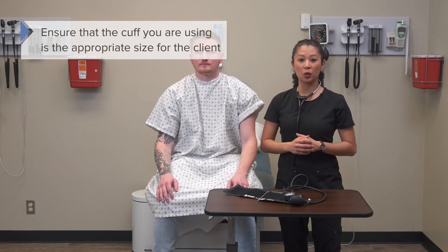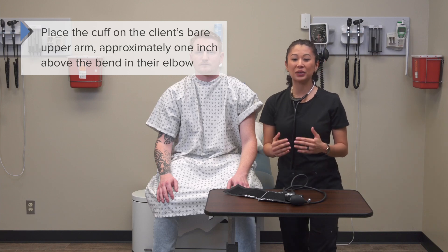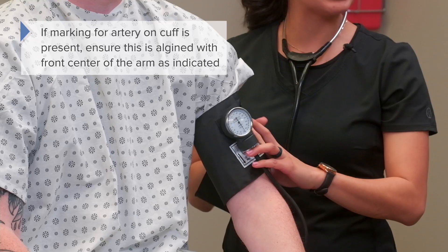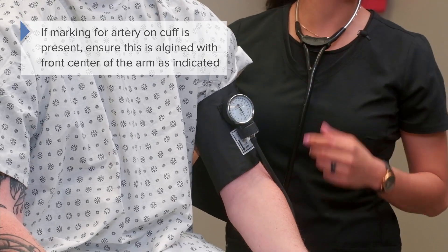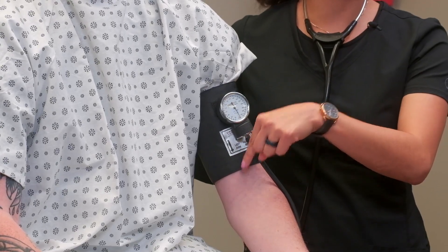Let's take a live look at how we take a manual blood pressure. The first thing we need to do is make sure our cuff size and equipment are appropriate. For example, I obviously would not want to use a pediatric cuff on Brandon today. So we'll place the cuff on the client's bare arm about an inch above the bend of the elbow, also known as the AC. Notice these handy arrows on the cuff — they should be pointing toward the patient's brachial artery.